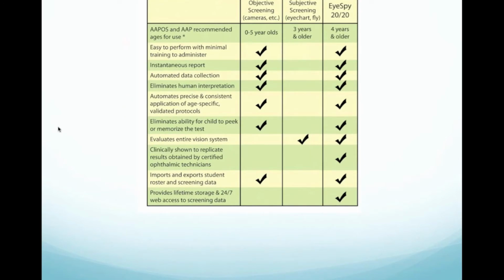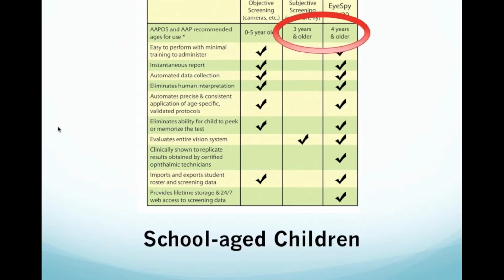So anyway, obviously I am preaching to the choir here. You guys are the experts when it comes to vision screening, but I just wanted to talk about EyeSpy and also subjective and objective screenings, because EyeSpy, as you'll see, is really a data-centric platform. In other words, the data that we collect is not relegated to just EyeSpy, but we can also collect vision screening data from objective vision screenings as well. And so what we're trying to do with EyeSpy is really combine the best of both worlds, as hopefully I'll be able to show you in just a second.